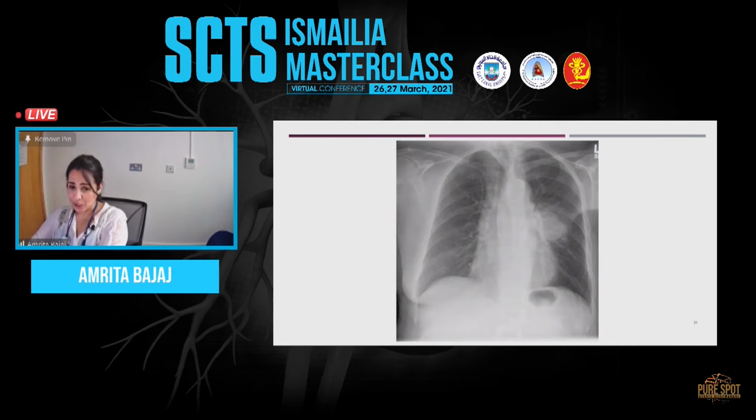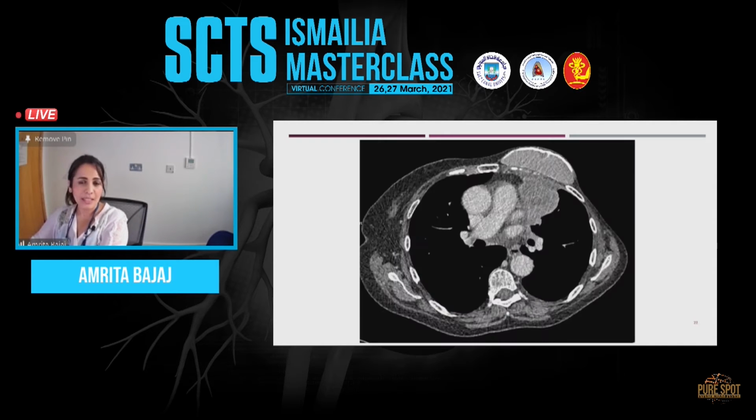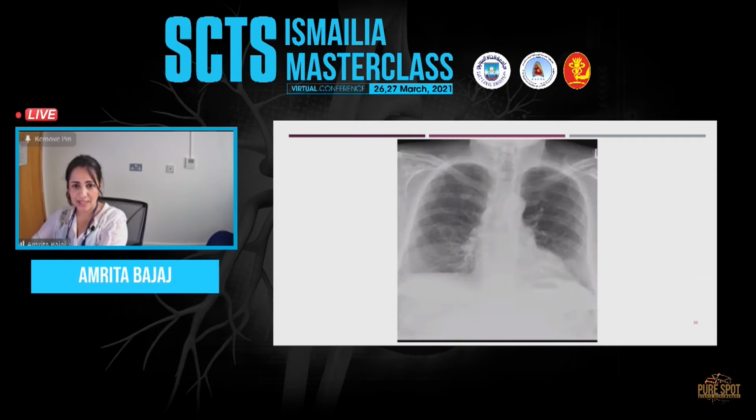This was an interesting case. This lady, for the ones who might have picked up, had a mastectomy on the left. And believe it or not, this was actually a malpositioned breast prosthesis, and the x-rays hadn't changed over years, but the lady was having hemoptysis. So the CT actually showed that there was a lesion behind the prosthesis, and that was found to be an incidental lung cancer. Just shows the limitation of a chest x-ray.